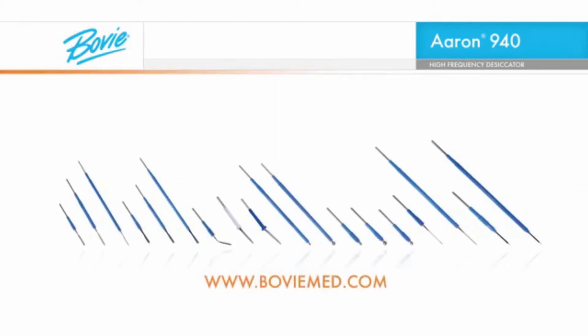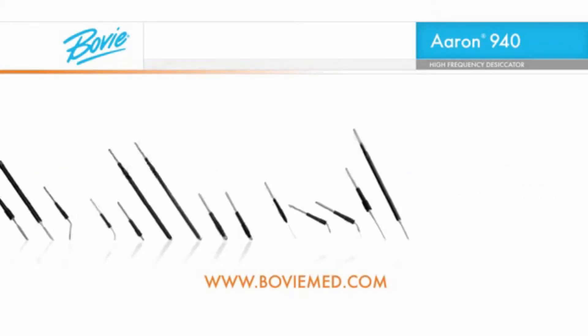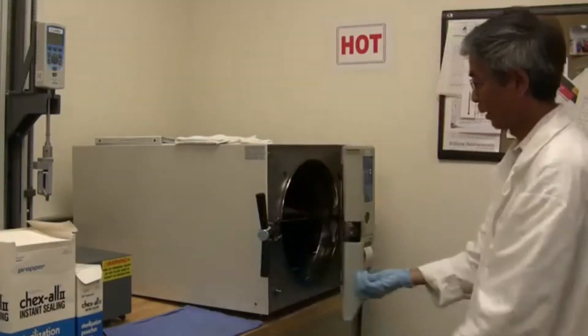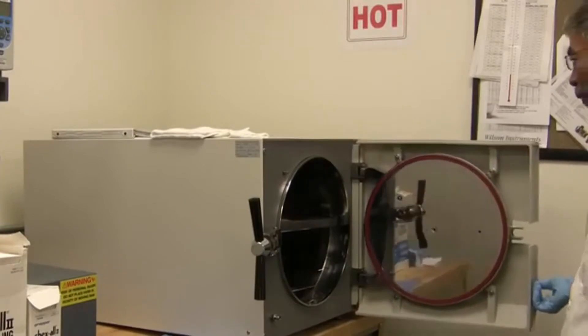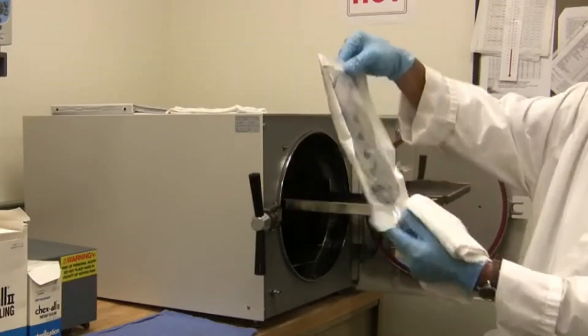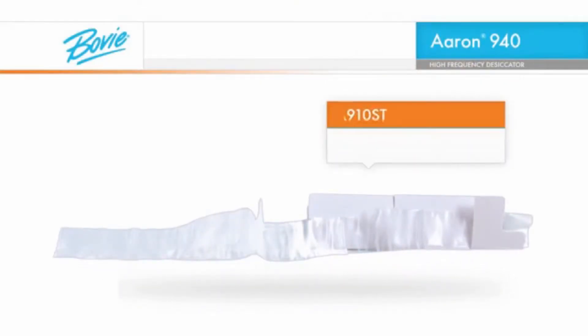A full selection of disposable and reusable electrodes is available from Bovee Medical Corporation. If handpiece sterility is required or if a handpiece should become contaminated during a procedure, steam sterilization is the recommended method. Or, if you prefer, the Bovee A910ST sterile drape can be used as a convenient alternative.